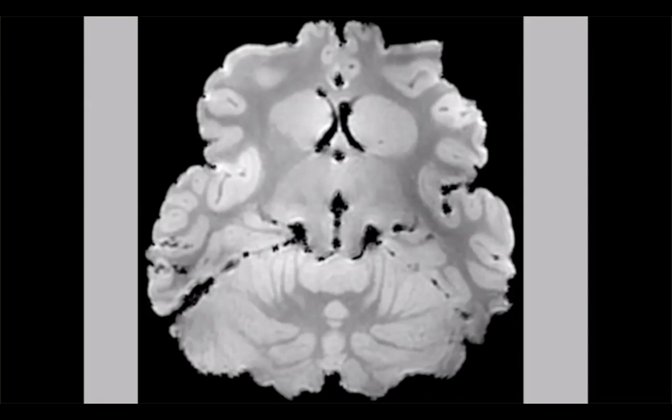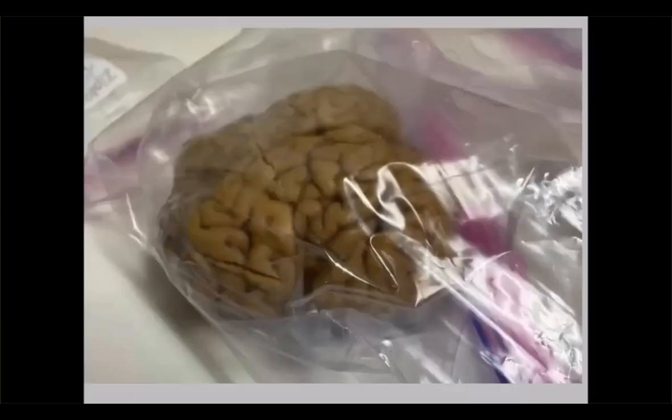And if we looked at the phase map, then I think you would definitely see significant phase distortions because of that. But I don't have the phase maps here. But it's a very common artifact when you have air tissue, because this brain is dead. The ventricles are pretty much empty, and so they're filled with air, and so are all the pieces here. And I think there's actually a cut in the brain here. They made a few cuts. As you see, there's a cut here, and then there's a cut here. This is a 1-year-old seal that died because of epilepsy.